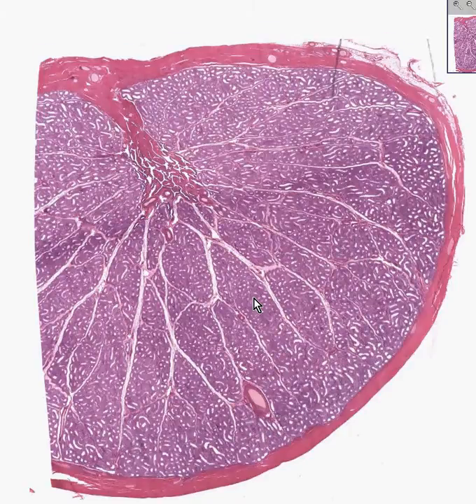Let's look at the classic histology of a testicle and follow the travels of the sperm to the outside of the male penis. Most of the cut section of a testicle is actually relatively soft, delicate seminiferous tubules separated by small amounts of connective tissue as well as thicker amounts of connective tissue. The whole structure is covered with a fibrous capsule. And you will also see an area, if you cut through a testicle, in which the tissue looks a little bit denser, which is regarded as the mediastinum testis, or rete, R-E-T-E testis.